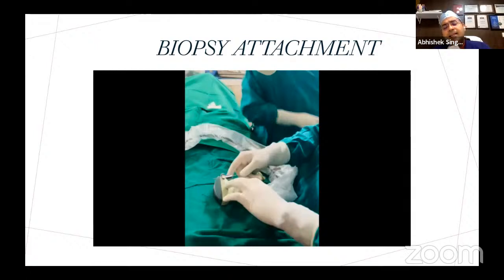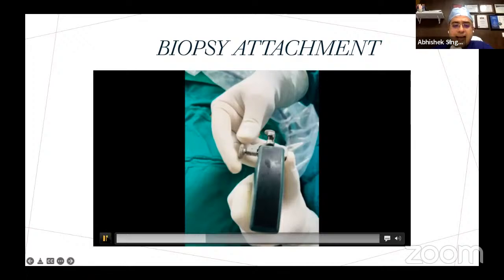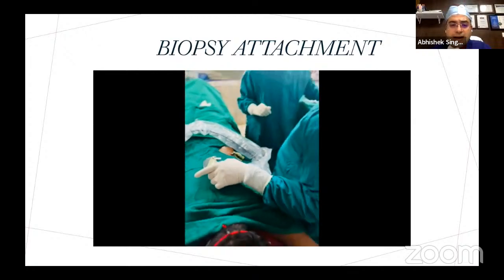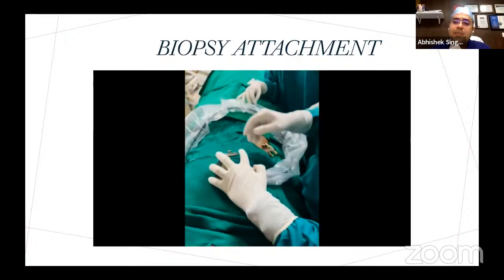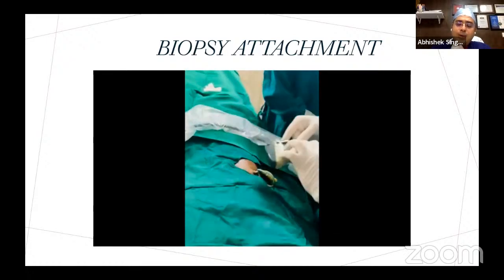The trick to do this is that there are two wheels which will help you tighten the puncture guide on the probe. The bigger wheel is opposite to the freeze button, and the smaller wheel is to tighten the groove through which the needle passes. So once you pass the needle, that is the time you balance the needle with your two fingers. Here I am putting the needle through the puncture guide and then balancing it with two fingers and then tightening the lateral screw. Depending upon how much freedom of movement I want, I should decide how much to tighten the lateral screw.